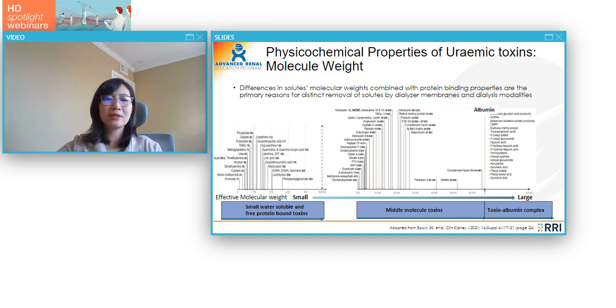That's the size the dialysis membrane really sees. So in the later part of this talk, we will use the effective size of the molecules to analyze their interaction with dialysis membranes.